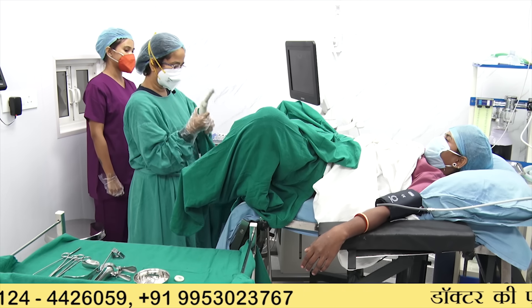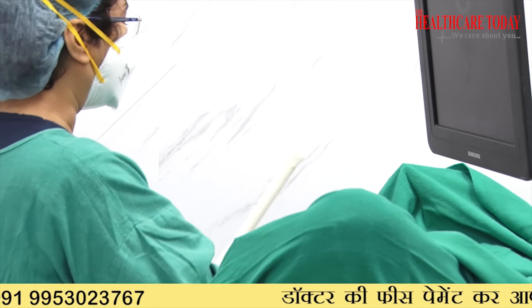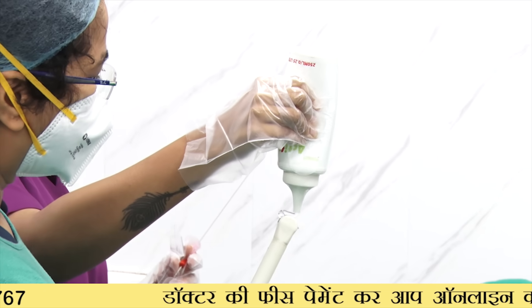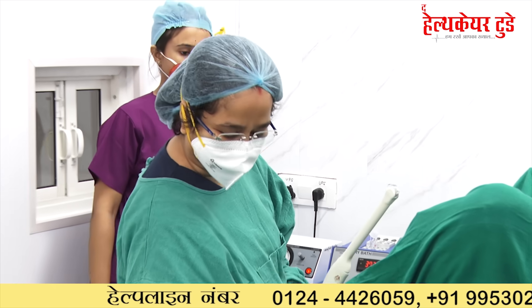We cover the ultrasound probe and put it on the drape.